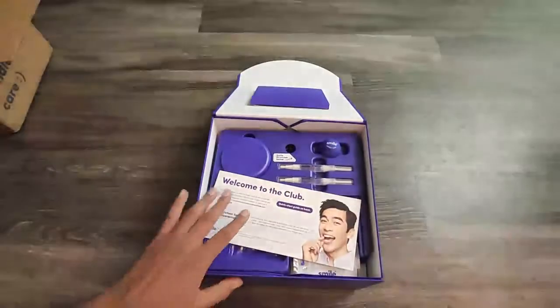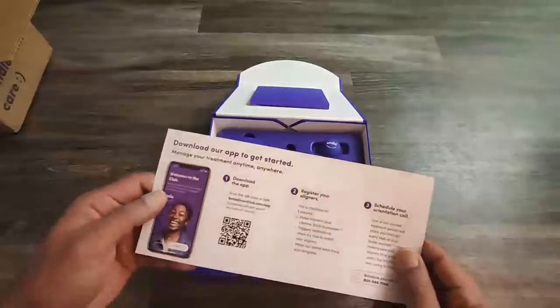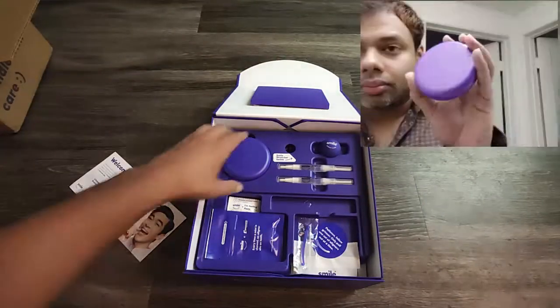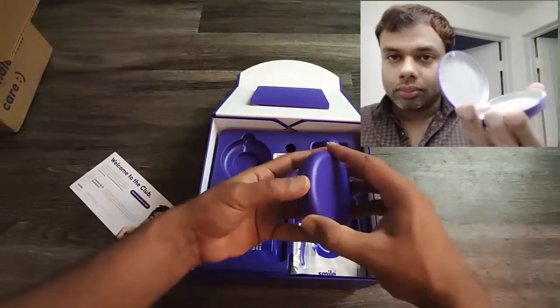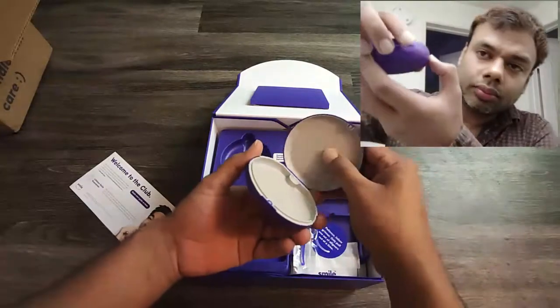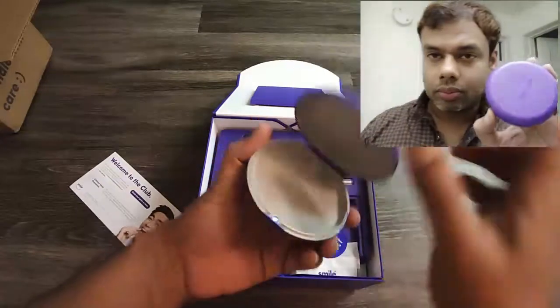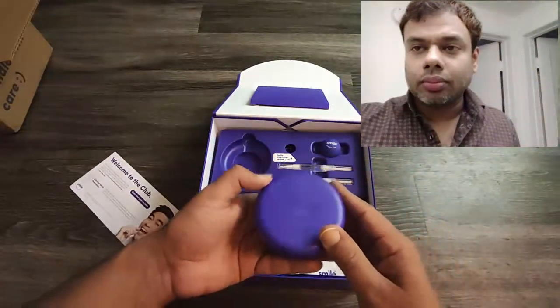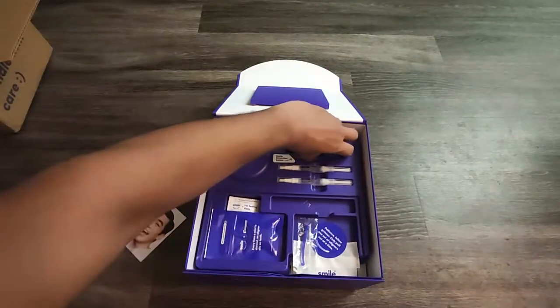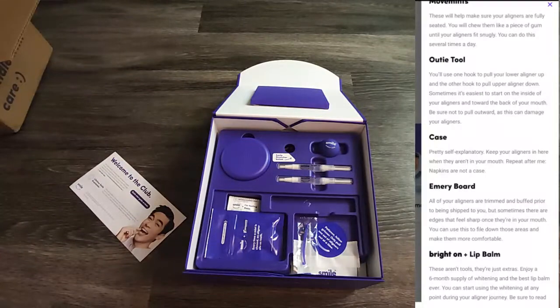Also included is a lifetime smile guarantee flyer — we'll talk more about that in future videos. There is also a case where you can store your aligners. As I show in the video, this is how you store the aligners inside the box. It has a magnetic open-and-close button. It's a bit small but you can adjust the aligner and keep it inside.